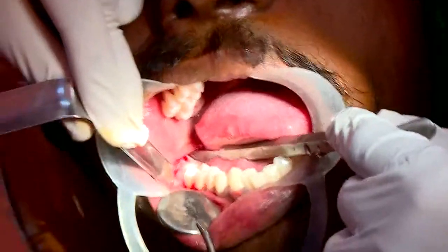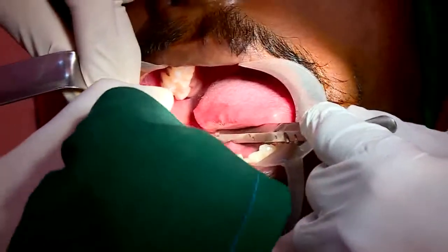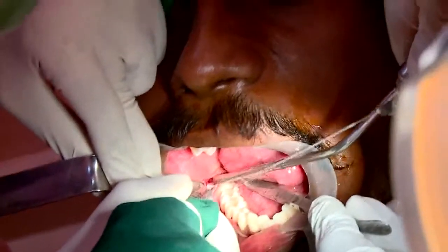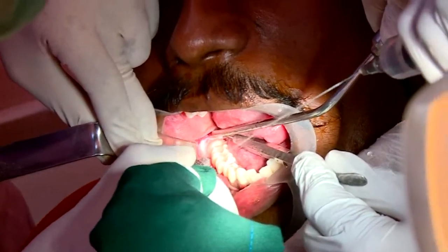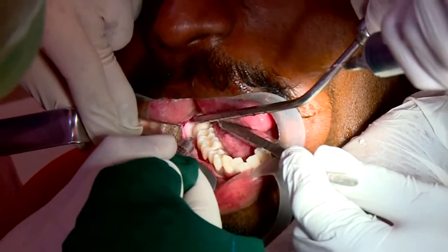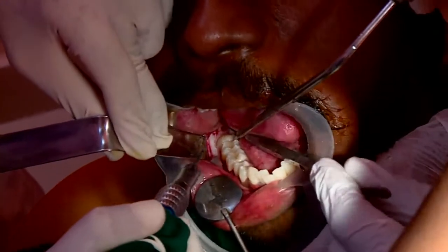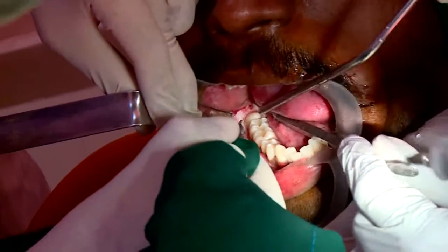Saline has to be copiously irrigated, with irrigation and wetting of the bone. You have to wet up to the marrow.